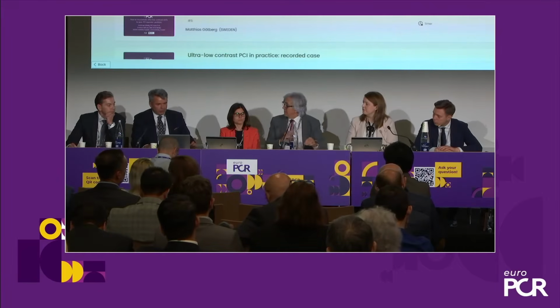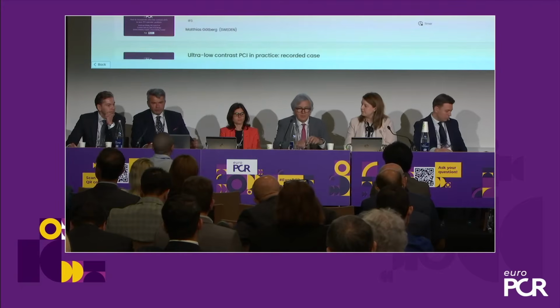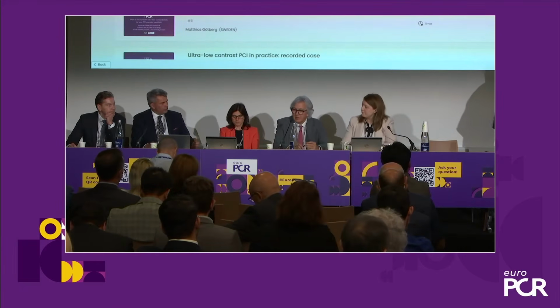So I would say that probably it is like ALARA, as low as reasonably achievable, in radiation. The same principle applies to contrast. Would you agree with that? And moreover, we should also focus on the planning. If you have a previous angiogram, you have the mapping. If you have the CT, you should think that you have something before, and not repeat and repeat with puffs.